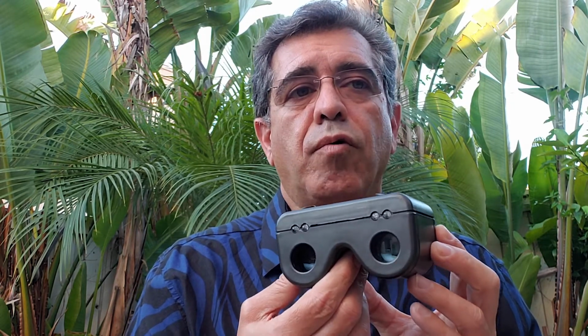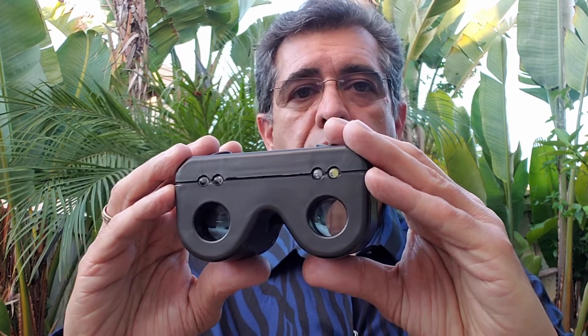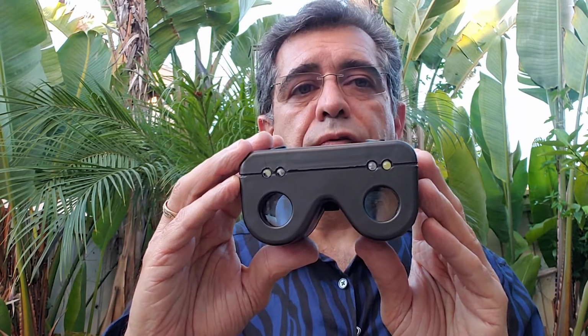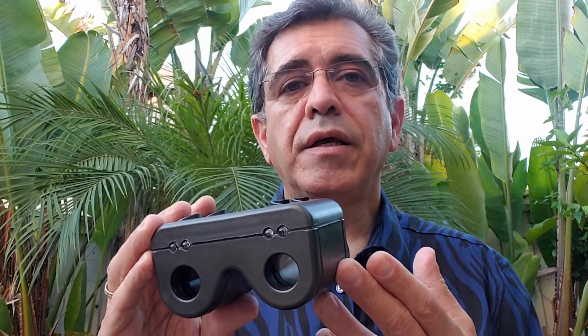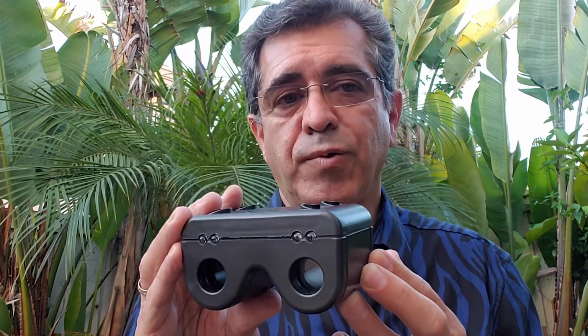So this device called APD tester magnifies both eyes, superimposes them over each other. You need to adjust your distance to the correct position relative to the patient. You would see the two eyes side by side, overlapping, or fused into one. Some clinicians may have a mild amblyopia or suppression or some other binocularity issue that could prevent them from seeing the two eyes equally well. If the amblyopia is not severe, the device still works for these examiners as well.